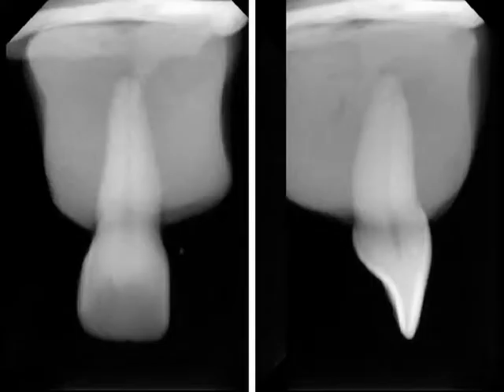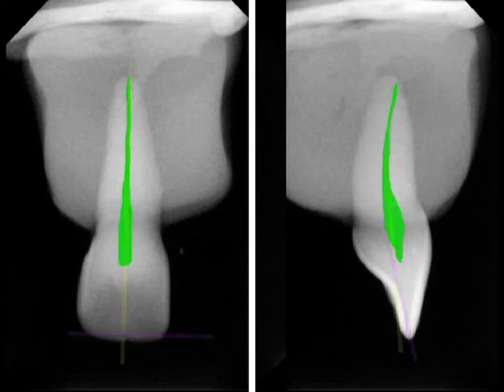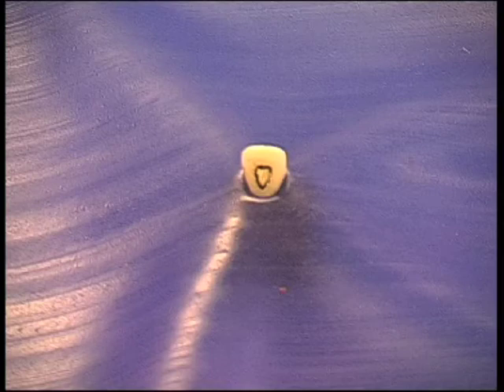A radiograph is essential to indicate the size and position of the pulp chamber, the alignment of the crown in relation to the root, the number and shape of the root canals, and the presence of any obstructions within the pulp chamber or canals. It is also helpful to gauge the distance from the incisal edge to the pulp chamber by marking a burr. The tooth must be isolated with rubber dam.